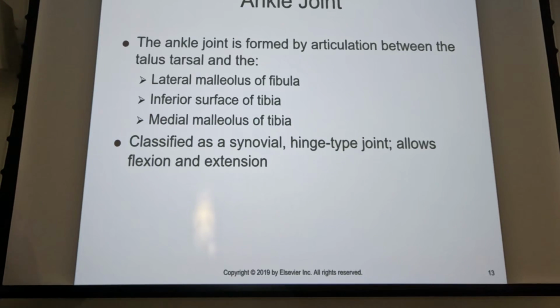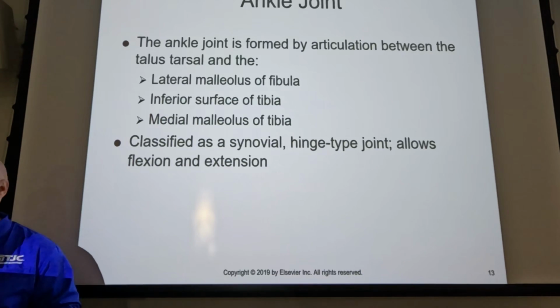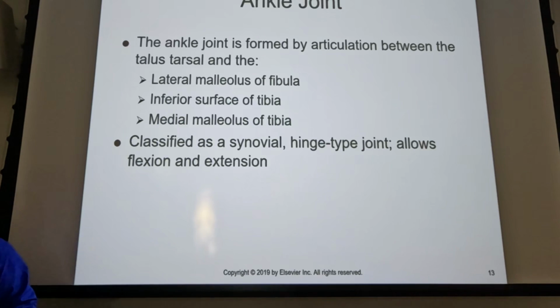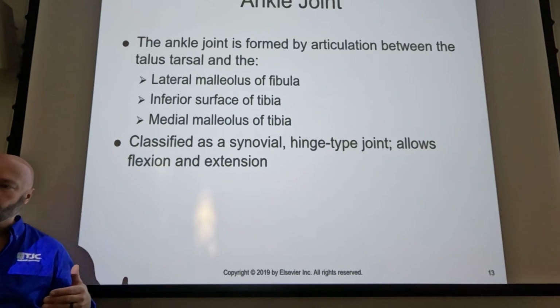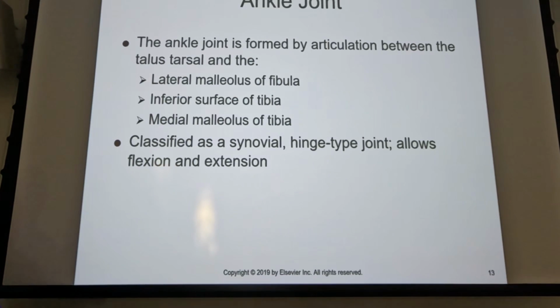There's some sort of damage to that syndesmosis, so it's a little bit more unstable. We're going to talk about highly unstable fractures here in a bit with a specific type of fracture and what you need to do with those. But if you see that screw going all the way from one bone to the other, it's because that syndesmosis is disrupted. It's not as stable as it could be.